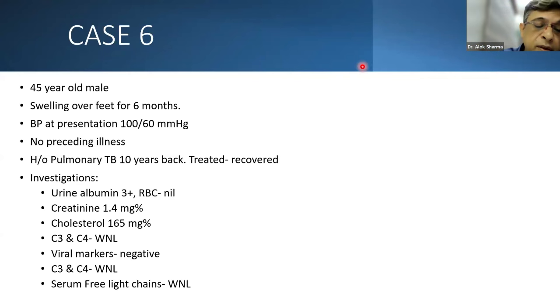But we also participated in that work. There was a paper recently published. We have now discovered that most of these deposits are actually composed of apolipoprotein E. So now you have an IHC marker for dense deposit disease, which is a very, very great step going forward.